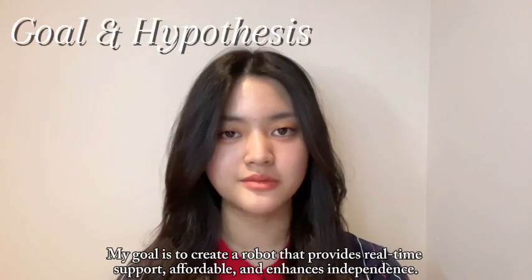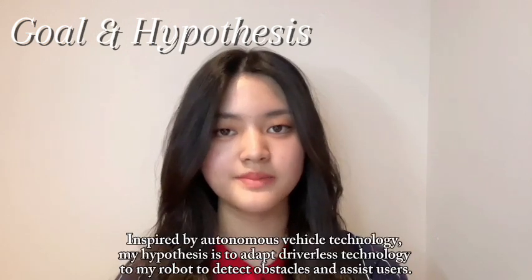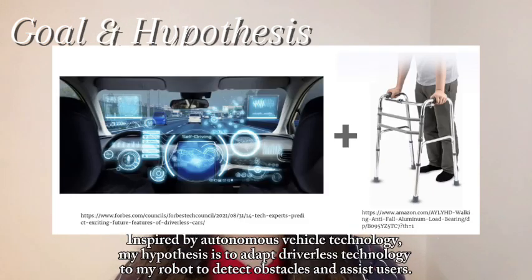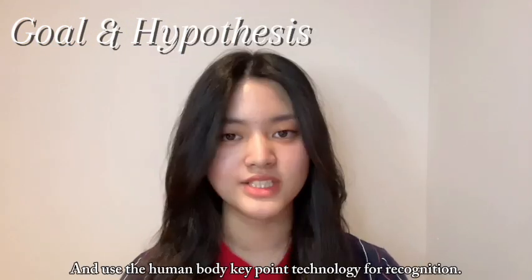My goal is to create a robot that provides real-time support, is affordable, and enhances independence. Inspired by autonomous vehicle technology, my hypothesis is to adapt driverless technology to my robot to detect obstacles and assist users, and use human body keypoint technology for recognition.